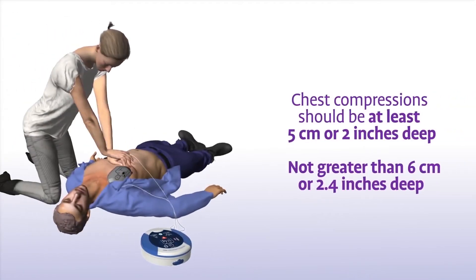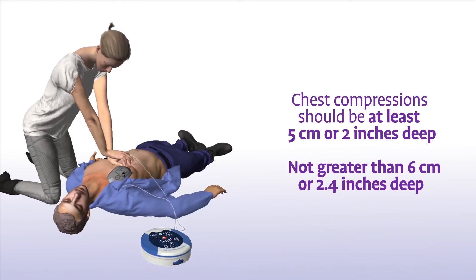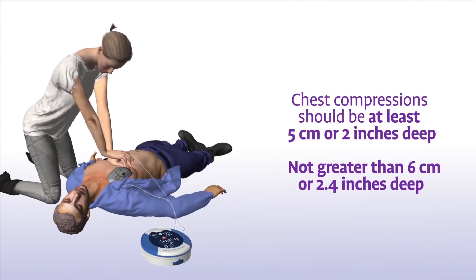In addition to staying in time with the metronome, your chest compressions should have a depth of at least 5 cm or 2 inches, and not greater than 6 cm or 2.4 inches, for adults and children greater than 8 years of age.